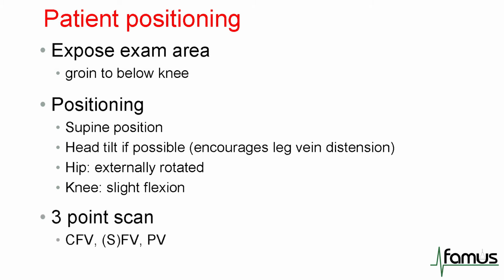And as I've touched on, we're going to be performing a 3-point scan: the common femoral vein, the superficial femoral vein or femoral vein, and the popliteal vein.